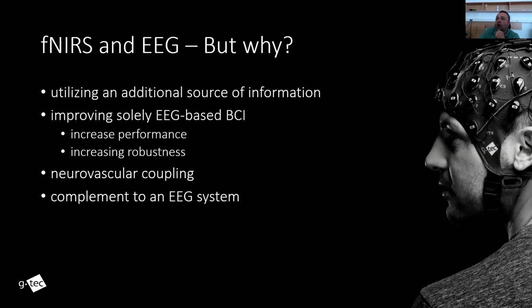As a question, why combine fNIRS with EEG? Because it uses an additional source of information. It improves the BCI performance, and also the robustness. Given neurovascular coupling, fNIRS is a very good complement to an EEG system.